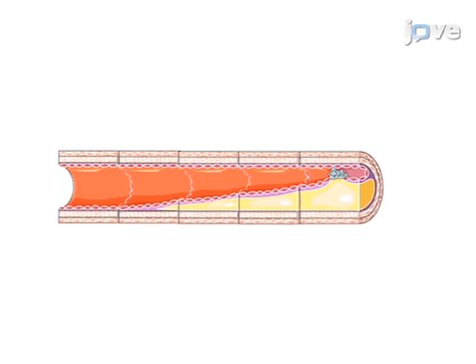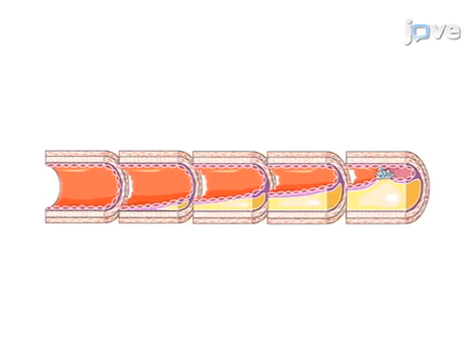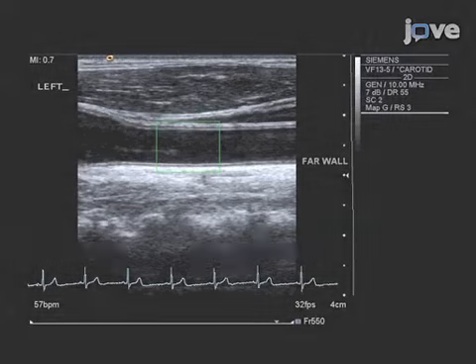The results show changes in microvascular and large vessel endothelial function in response to stimulation. In addition, the vessel wall of the carotid artery is also characterized. These methods can help answer key questions in the field of cardiovascular physiology, such as determining the impact of interventions on vascular health in different clinical populations.